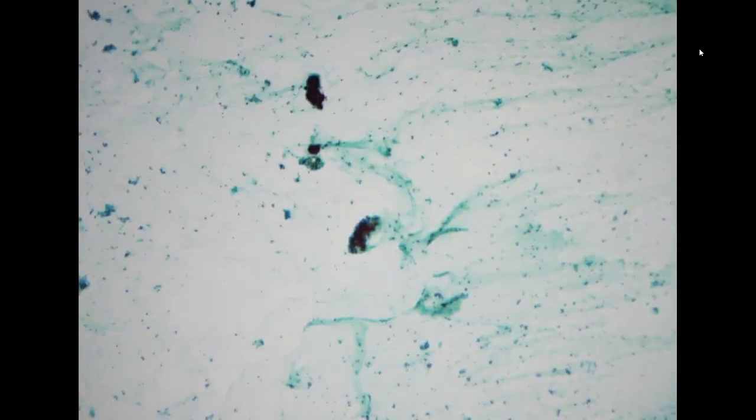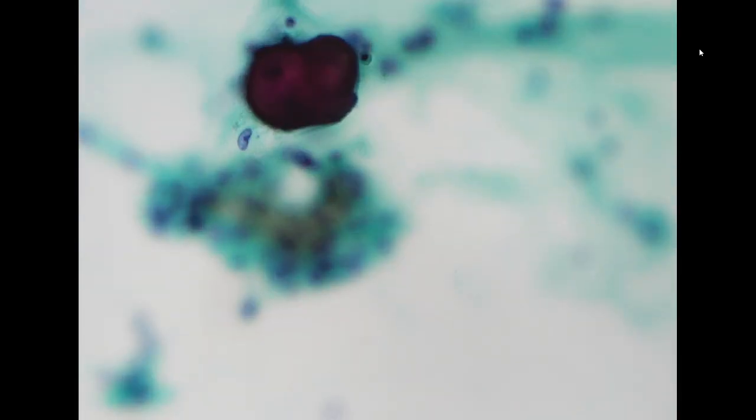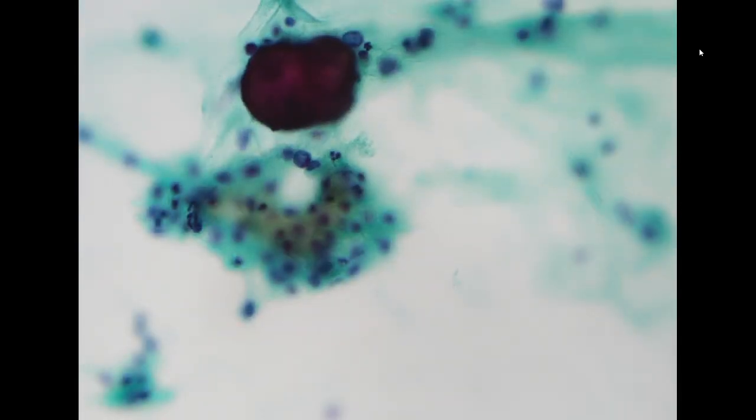Then we go ahead and screen around, and it is also interesting that what is this? These are psammoma bodies, right? Psammoma bodies do not occur in the usual HPV positive adenocarcinoma.